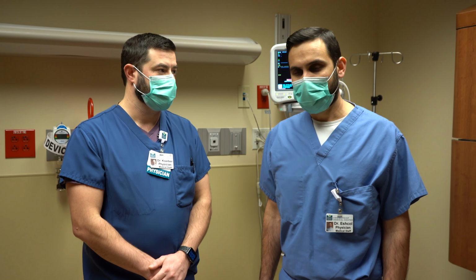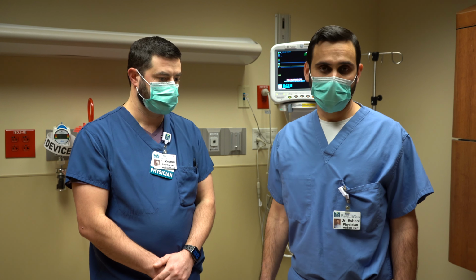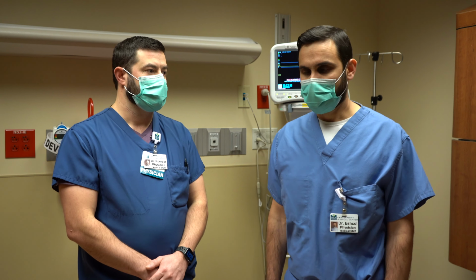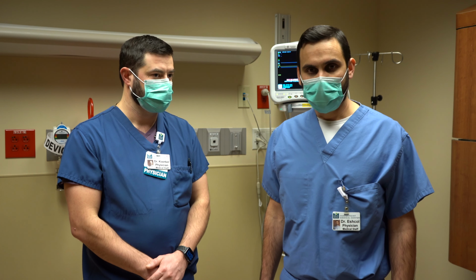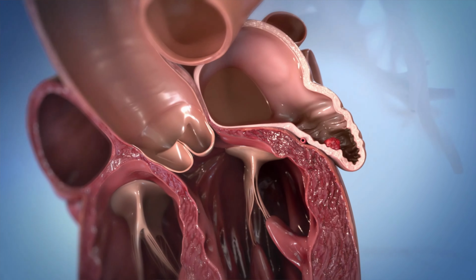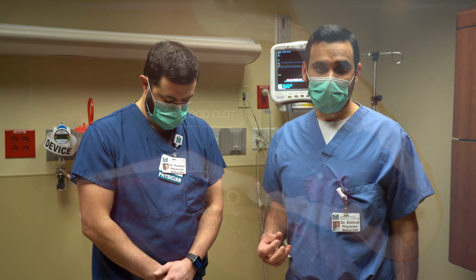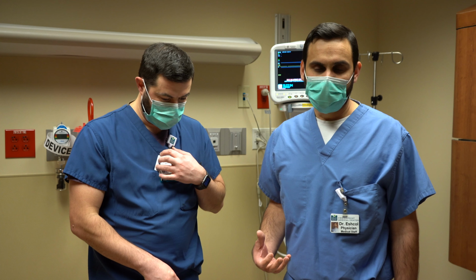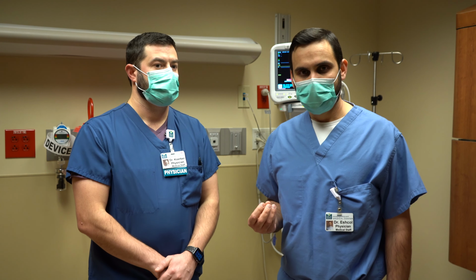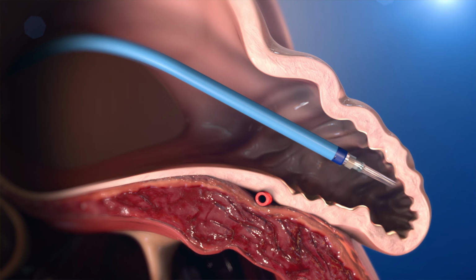But as you can imagine, sometimes patients can't take blood thinners. In those patients, there's a really good, suitable alternative that's been available since about 2015 and has gradually been implanted in thousands of patients. It's called a left atrial appendage closure procedure. This procedure addresses a small pouch in the heart called the left atrial appendage, where most of the large strokes come from. Instead of using a blood thinner to prevent clots from forming in that pouch, we can put a device into that pouch and seal it off so that clots don't form and we can prevent stroke.